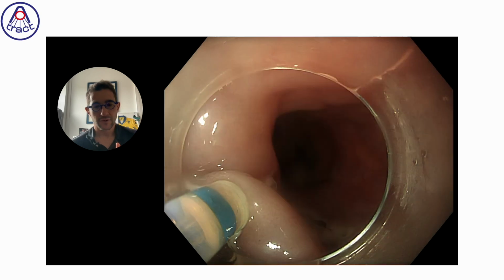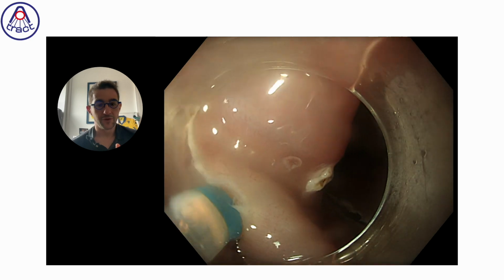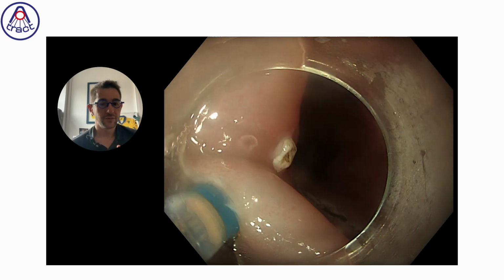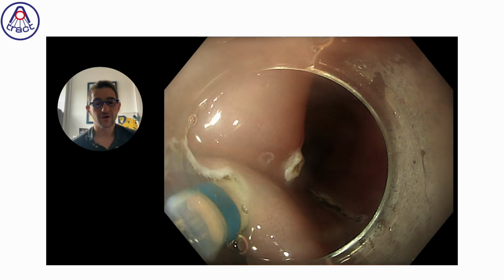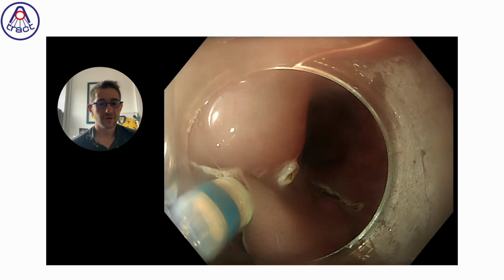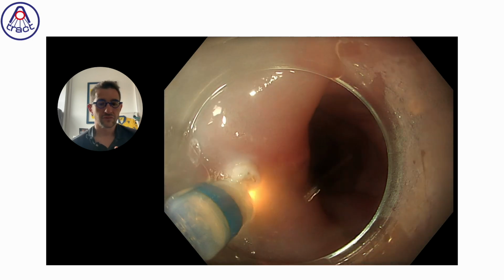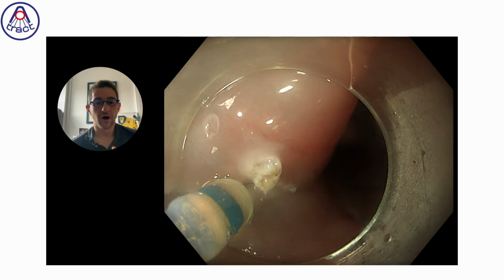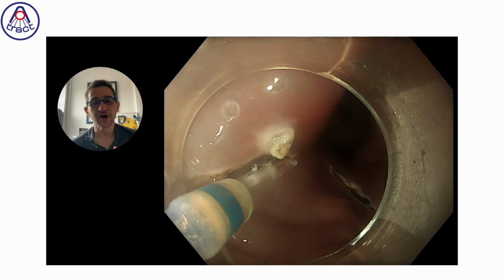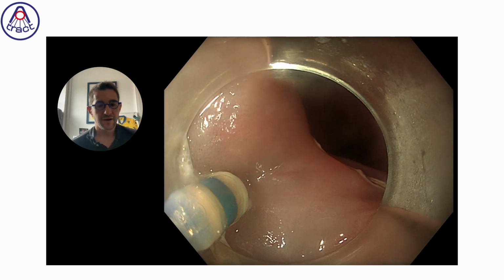Here you should find a way to have a kind of opposition of the tissue, but without creating a fold, which is more difficult to cut. I was not totally happy here because I wanted him to go on the dot and not in the dot, but it was okay. Finally, we have margin.